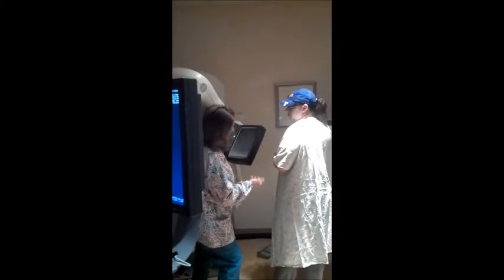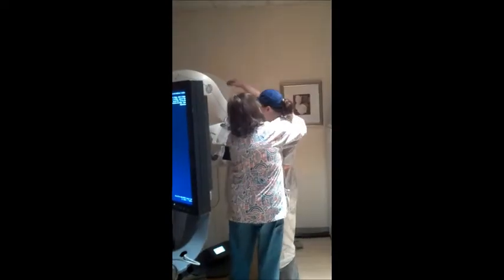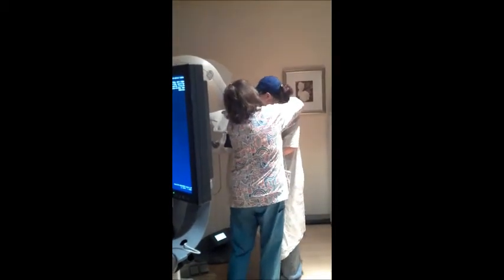We try to encourage our patients, but we won't hurt them either. I'm always asking you, are you doing okay? I don't want to scare you into never wanting to do this again.